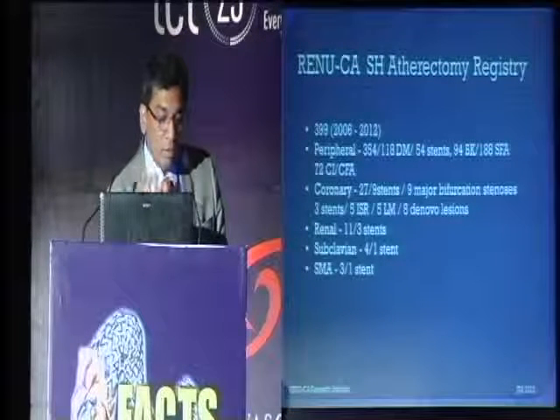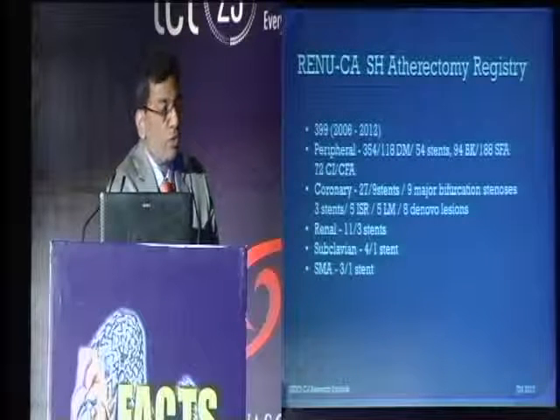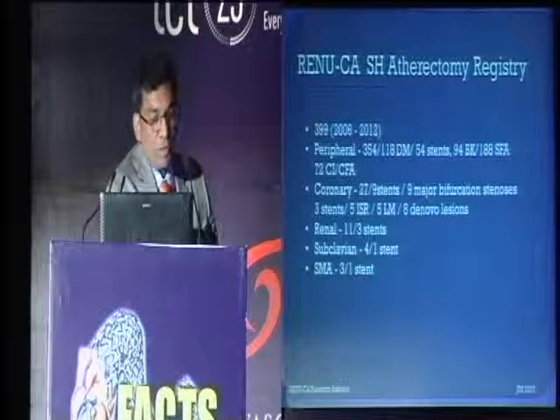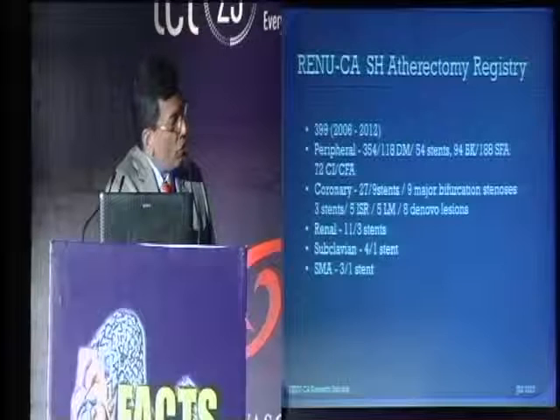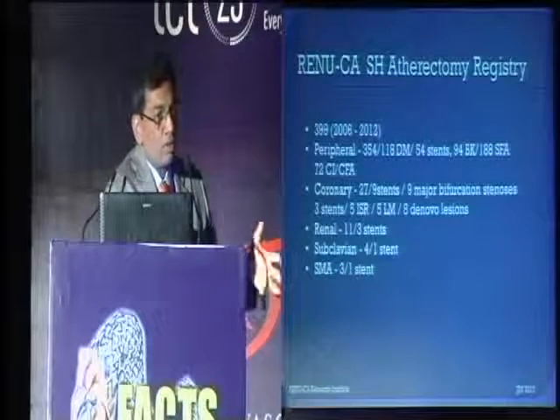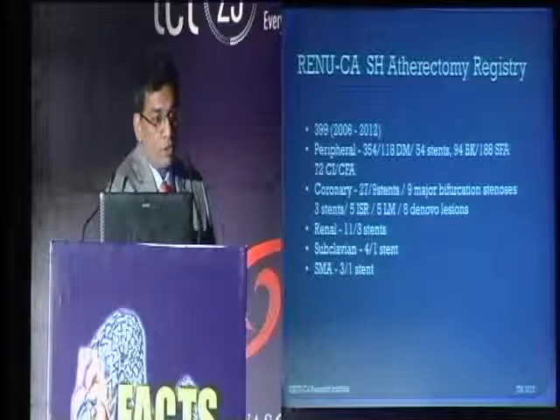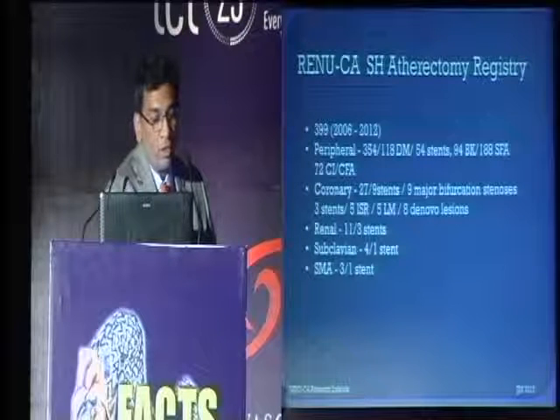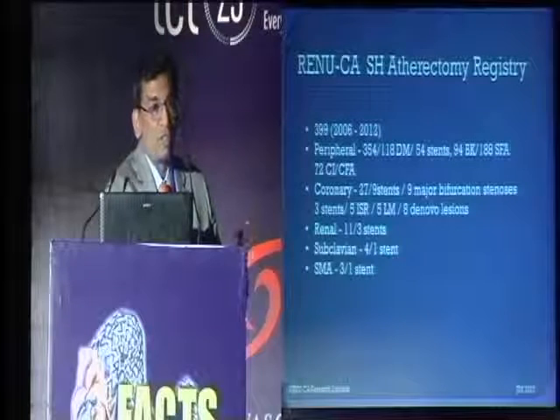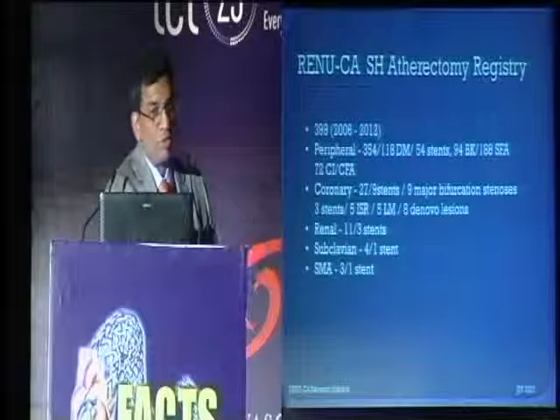At the place I'm at, the Lankenau Research Institute in Philadelphia, Pennsylvania, we've developed novel approaches to manage complex disease. Silverhawk atherectomy is one of the things, especially for bifurcation, in-stent restenosis, and ostial disease. We use directional atherectomy heavily. Based on our experience with Silverhawk, I don't advise Silverhawk to be used in coronaries as an ad hoc device that you can pull off the shelf.